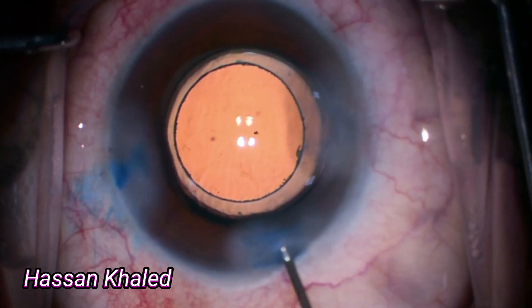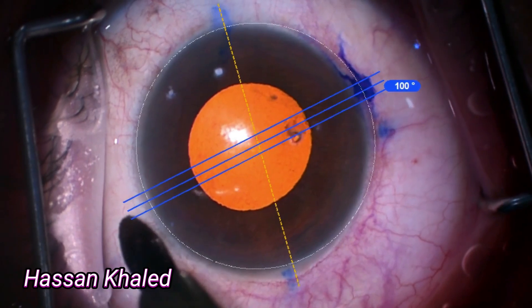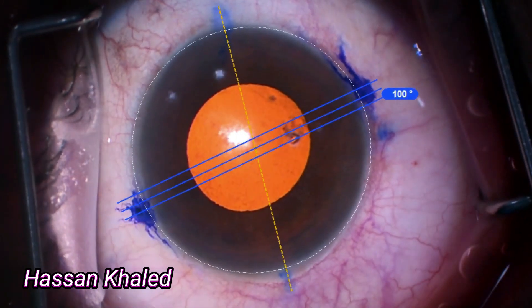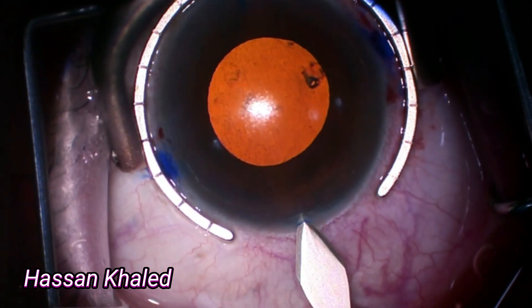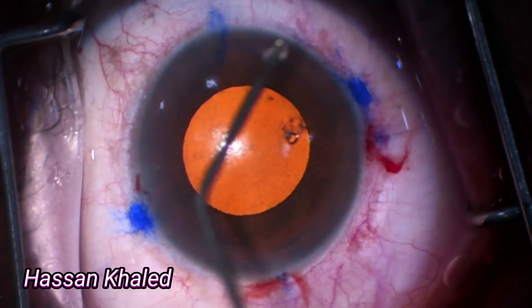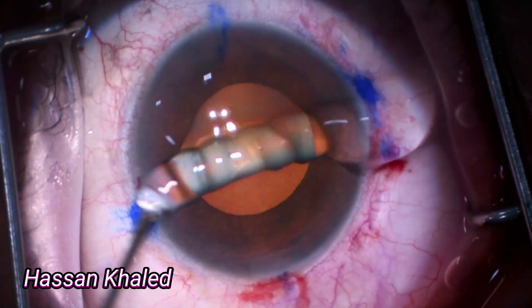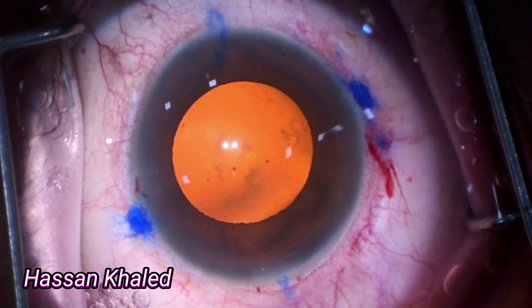The second case is a patient who has corneal astigmatism. Here is my plan to implant a toric IOL. The axis of placement is 100°. The corneal incision, then two paracenteses, then the main phaco incision. Applying HPMC over the cornea, then using Capsule Blue 0.4% to stain the anterior capsule.